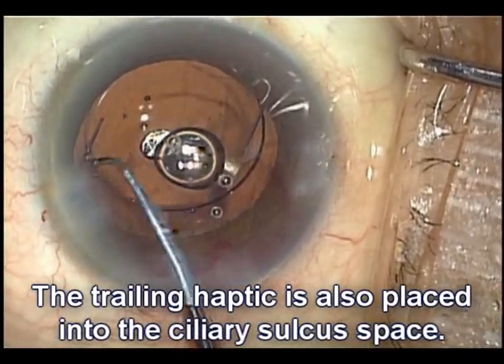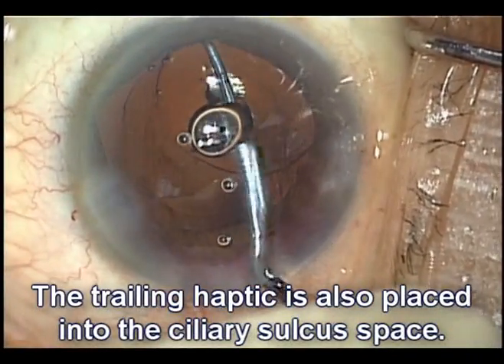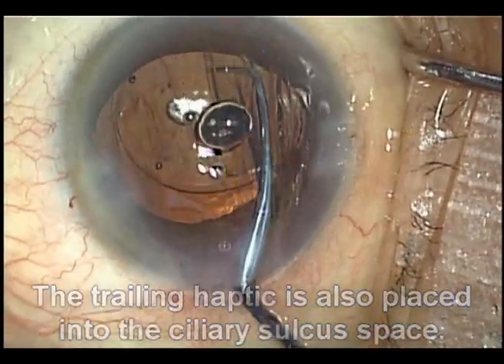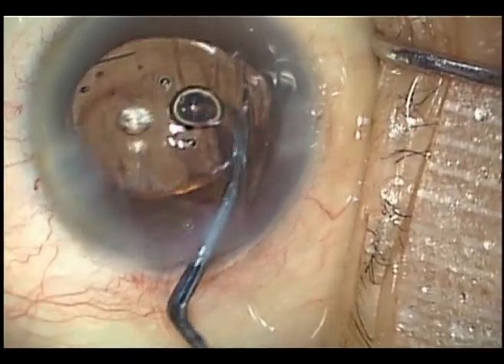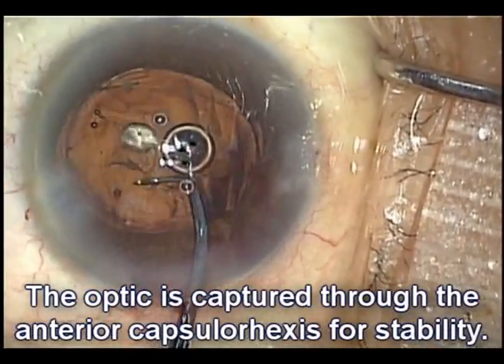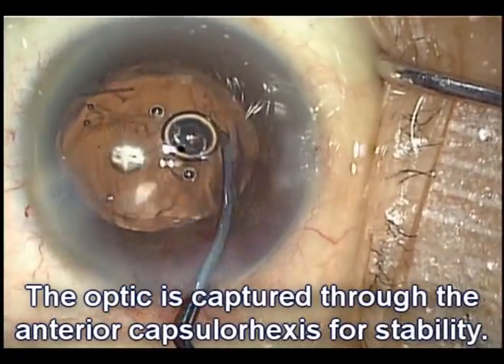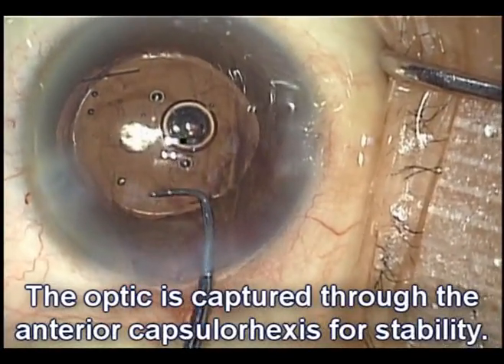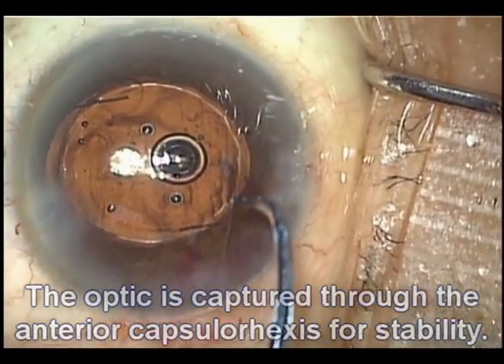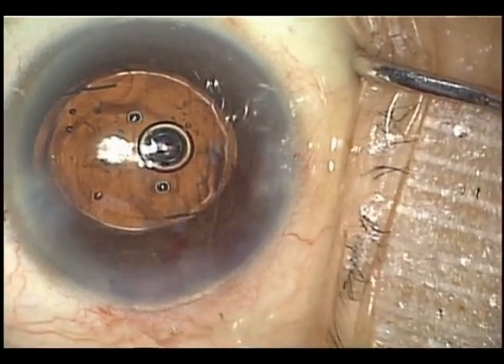We'll do a special trick here: we'll place that haptic in the sulcus. Right now the entire lens is in the sulcus. Instead, what we're going to do is capture the optic under the rhexis. You can see this is what we're doing at the moment. By doing this, we have a very secure fixation of the lens — it's like a button through a buttonhole. It's not going to go anywhere. Importantly, it also creates a barrier.